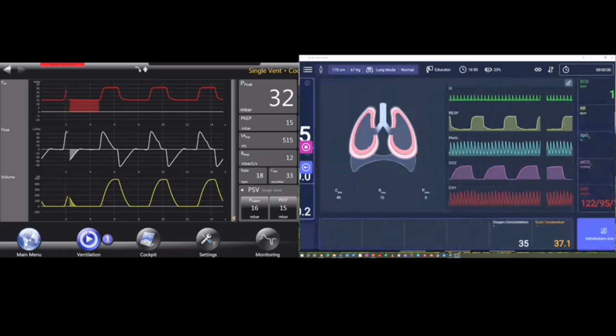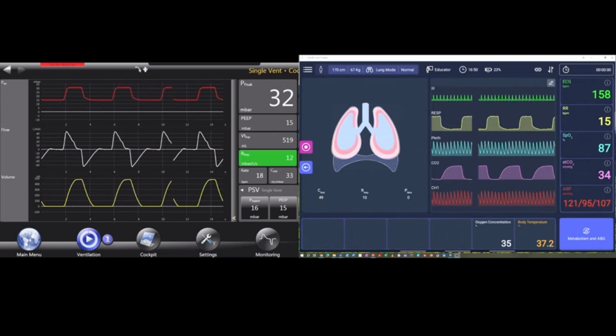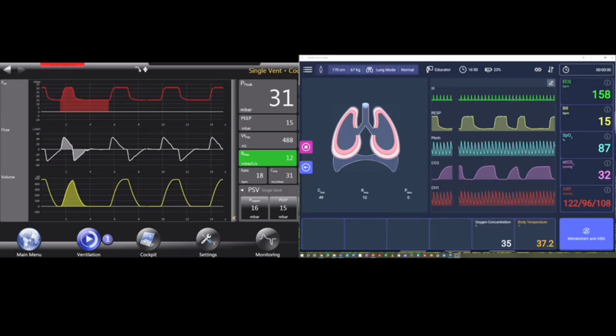So when you want to change the severity of your condition, you can do this via the incident. Going back to the patient, the saturation is rising slowly because we do not have any additional oxygen right now. So this will take a while until the patient gets healthy again. And we also see that the heart rate is really high. So I think additional oxygen would help.